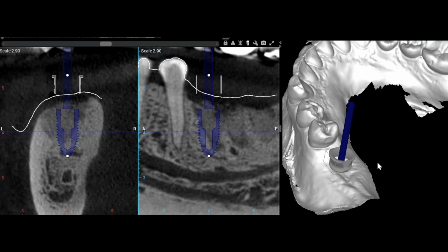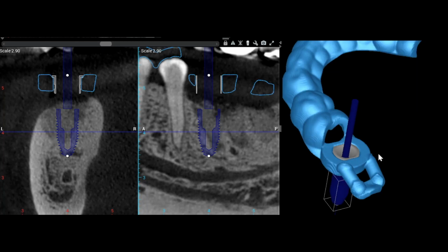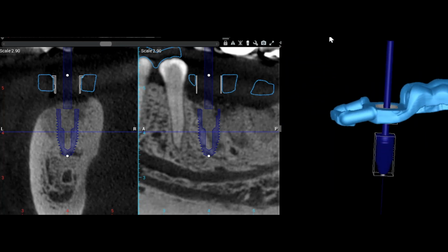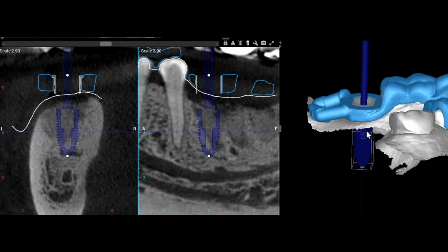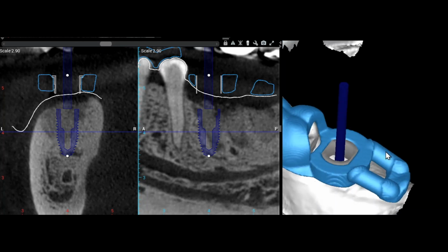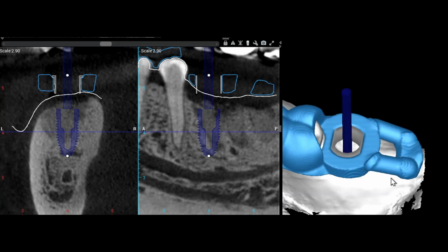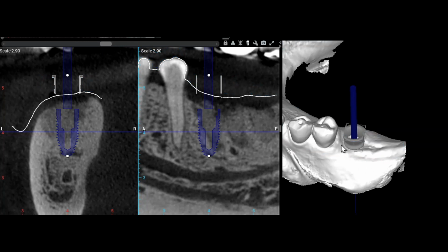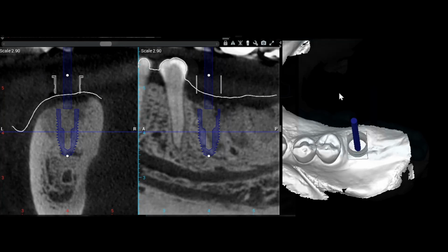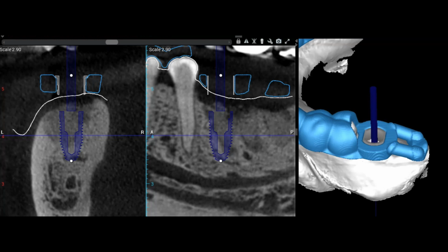Now, when we're looking at our surgery, you can either do the case flapless, of course, or in the case of the posterior mandible, most likely you don't have enough keratinized tissue. So normally what I do is I will create right at the mesial extent of the posterior patch that's being supported, a little bleeding point right there, and then I'll take off the guide, and then I'll use that as reference for my flap design. So I'll do a little horizontal, like crestal vertical incision. I'll do sulculars on the teeth in front, and then I'll connect that together with a crestal incision, and then I'll flap it. So that way, the tissue posterior to your implant is being covered by the guide, and that will eliminate that risk of unseating while you're doing surgery.